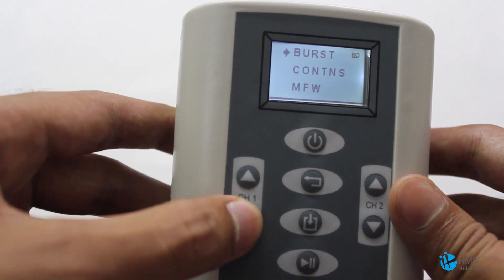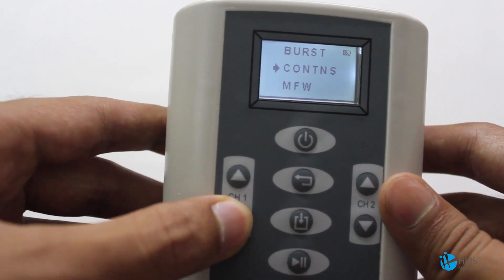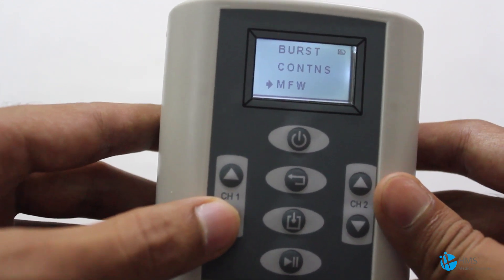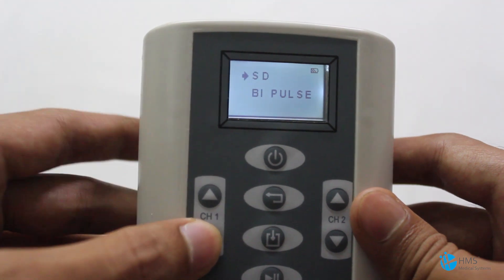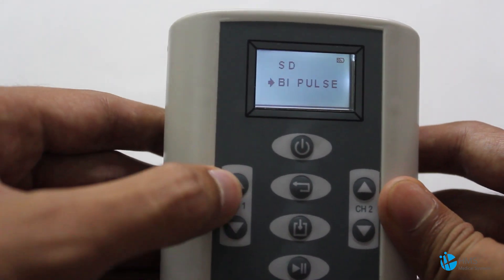The five different modes are: first, Burst Mode; second, Continuous; third, MFW which is called Modulated Frequency Width; fourth, Strength Duration; and fifth, Bipulse Mode. These two buttons are used to navigate through the modes, and this is the Select button.